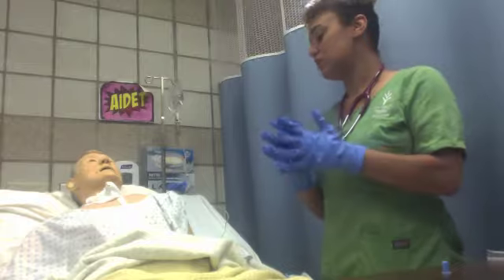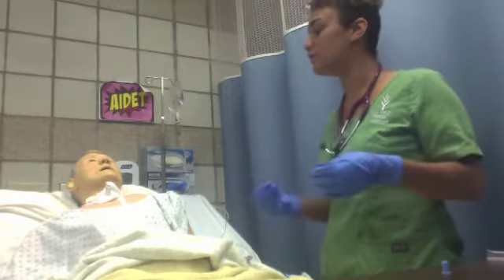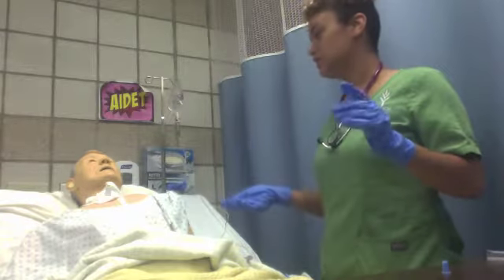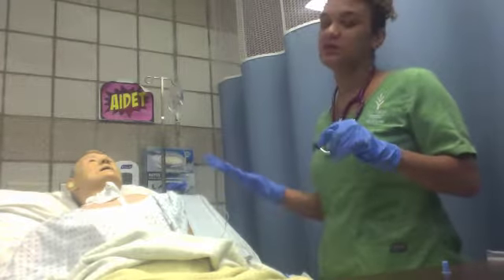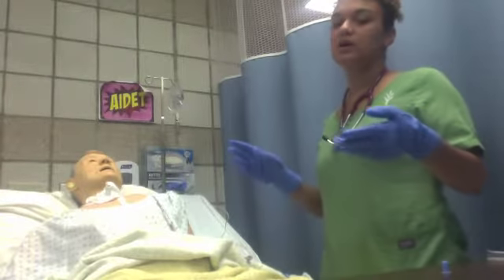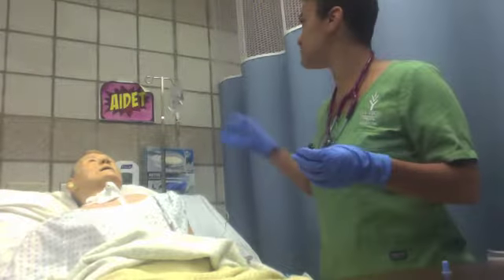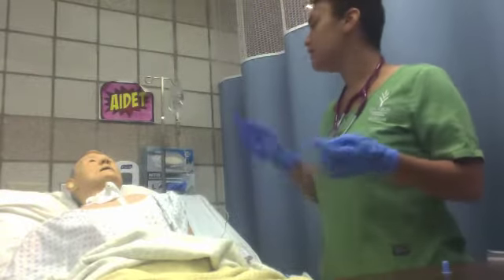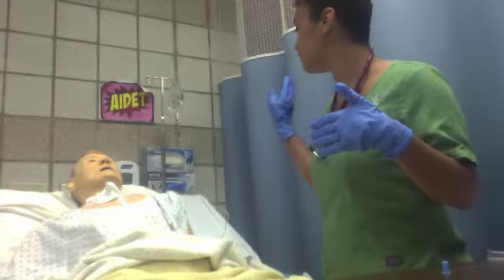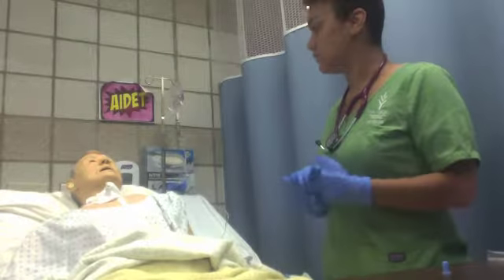All right, so if you need me, or if you start to feel uncomfortable, pain, anything like that, are you in any pain right now? Can you rate that for me? So there's no pain noted at this time. If you do start to feel pain, discomfort, you see any of the things that I was looking for that I mentioned earlier, if your bag is about to run out, or if you hear the alarm sounds on your machine, just give us a call and we'll come in and we'll help out with that.